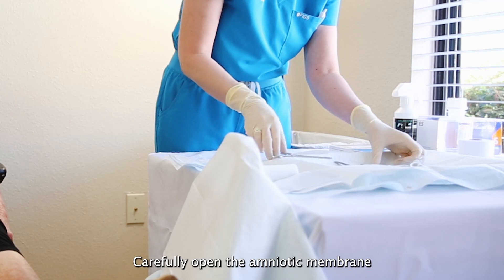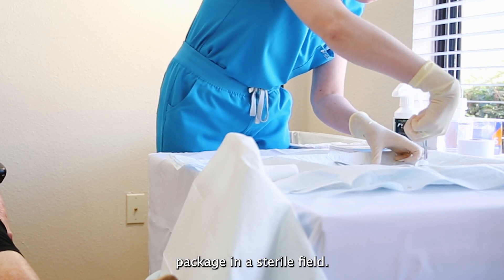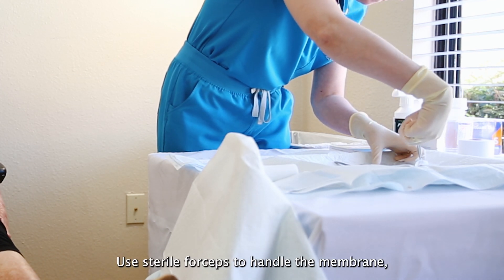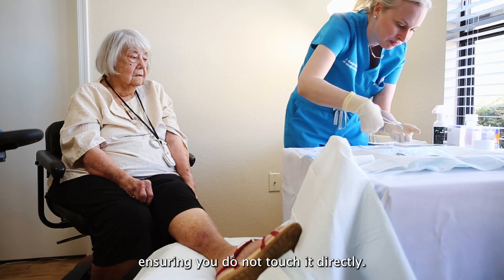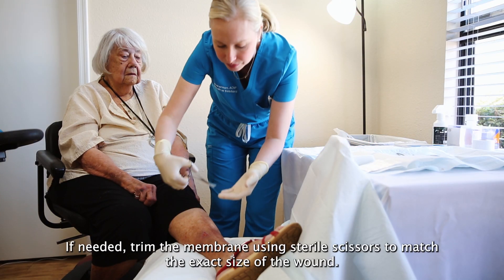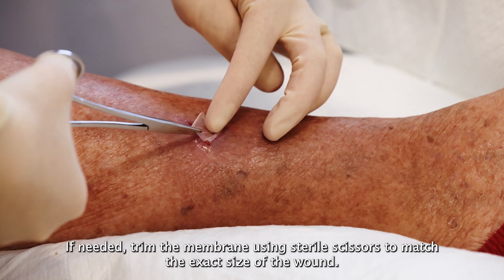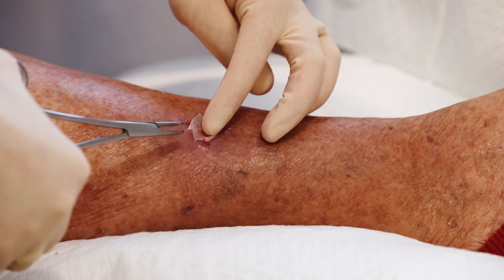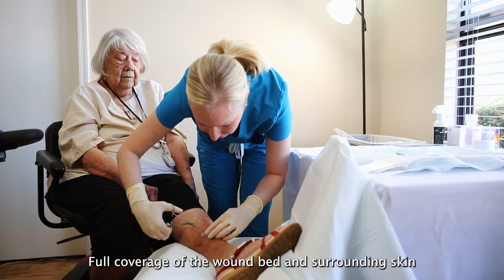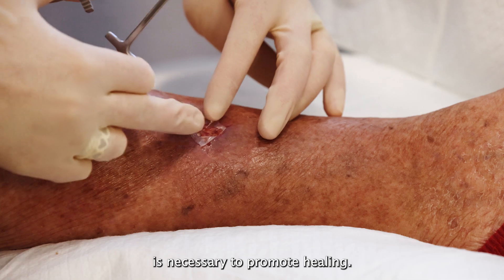Carefully open the amniotic membrane package in a sterile field. Use sterile forceps to handle the membrane, ensuring you do not touch it directly. If needed, trim the membrane using sterile scissors to match the exact size of the wound. Full coverage of the wound bed and surrounding skin is necessary to promote healing.